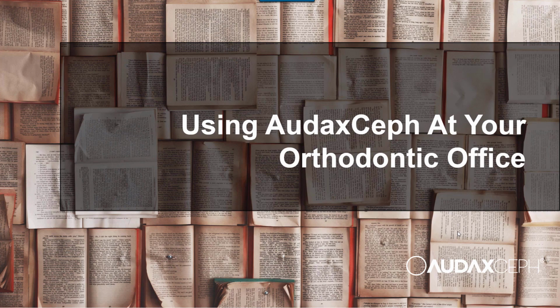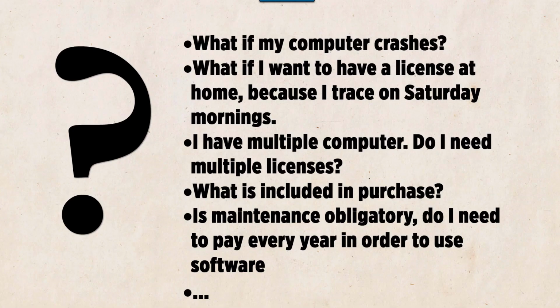We will talk about using AudaxCeph at your orthodontic office today. You learned perhaps somewhere about AudaxCeph, you find it nice, there are enough functionalities, probably all you need and even more, but there are also so many questions still unanswered, such as what if my computer crashes? I have 3 computers, do I need 3 licenses? What's included in the purchase? Is maintenance obligatory and so on? And because you do not know the answers, you do not upgrade from your old, less productive system or even do routine tasks such as tracing your x-rays manually.